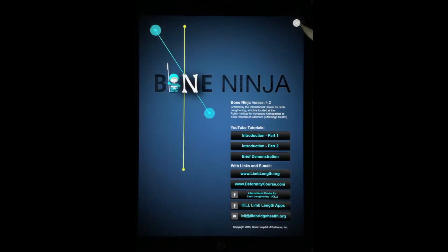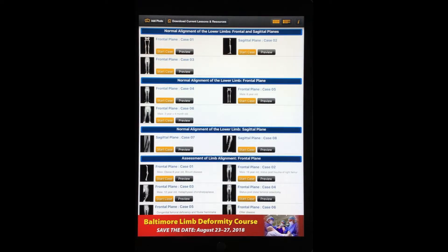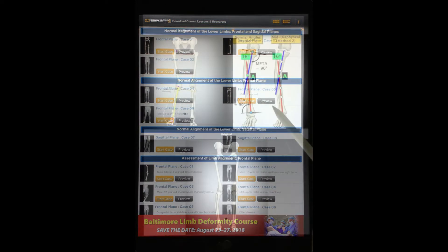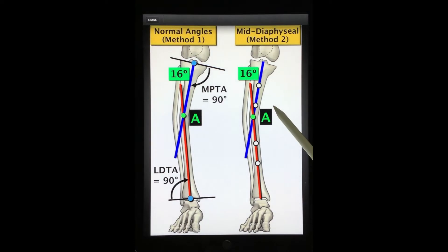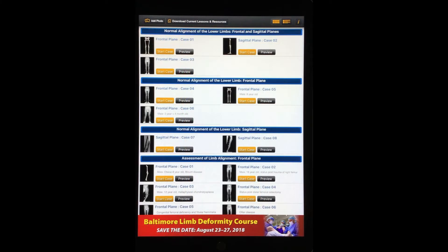To correct a deformity, one must first characterize the type of deformity and then appropriately plan a corrective strategy. Bone Ninja comes pre-loaded with case examples of normal and deformed bones to use for practice. Each case example is accompanied by a recommended solution so that a student can receive feedback. We feel that this case-based approach will assist clinicians in learning bone deformity analysis and correction.